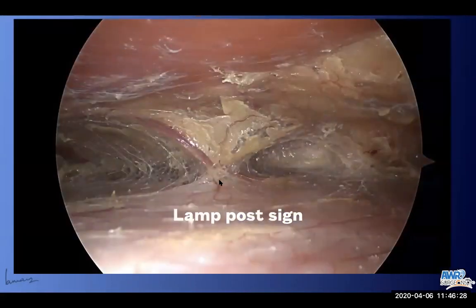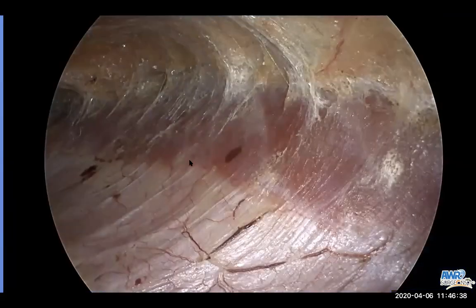The second is the lamppost sign, which is the neurovascular bundle arching up to the ceiling. This is the musculo-aponeurotic junction of the posterior rectus sheath, showing the transversus abdominis muscle covered by the posterior lamella of the internal oblique, and this is just the posterior rectus sheath.